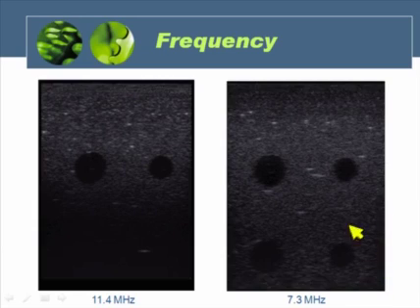However, remember that while we don't have adequate penetration with the 11 megahertz transducer, we will have higher resolution, and in fact you can see better detail in this structure than in this structure. Again, always use the highest frequency transducer that you can for the part being imaged.